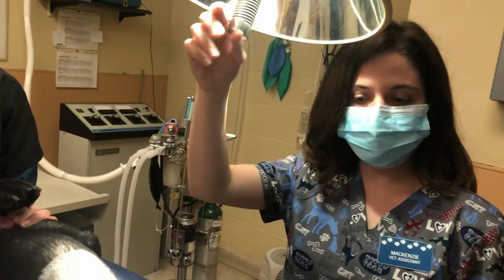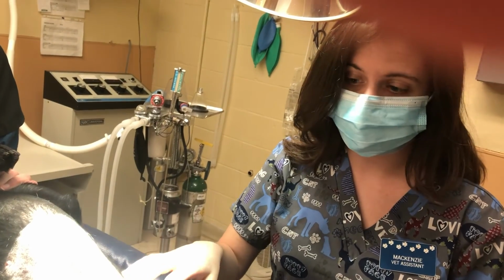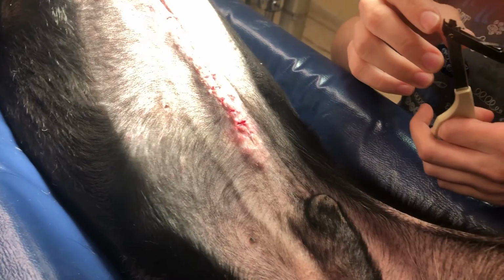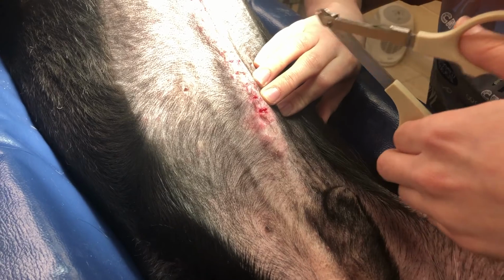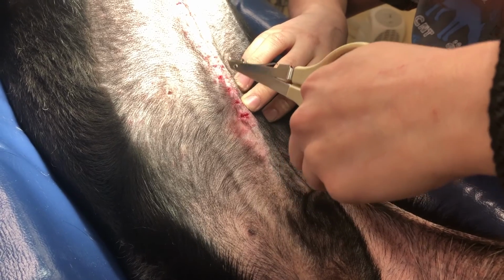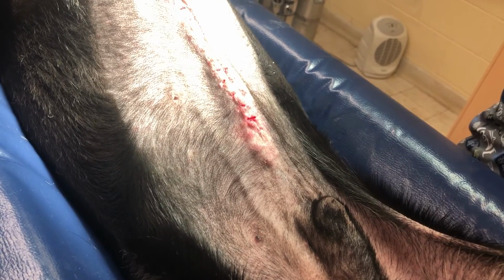So now I'm going to demonstrate how to remove sutures. In this case, they're going to be staples from an incision. So I have my staple removers. I'm going to take these two little spots right here and go underneath the staple, and then I'm going to click it down into place, and it'll break the staple into two so I can pull it out like that. Put that over here so I don't lose it.